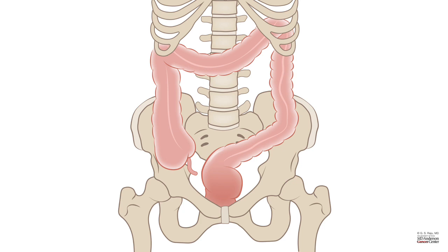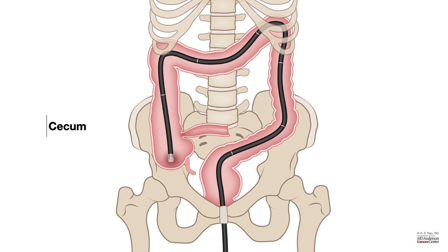and we have passed the endoscope to the beginning of the colon, otherwise known as the cecum. And once you are in the cecum, you identify the cecum by the opening of the appendicular orifice. So here is the appendix, and this is the opening that you check and take a photograph.